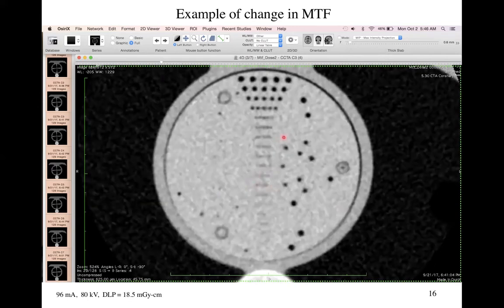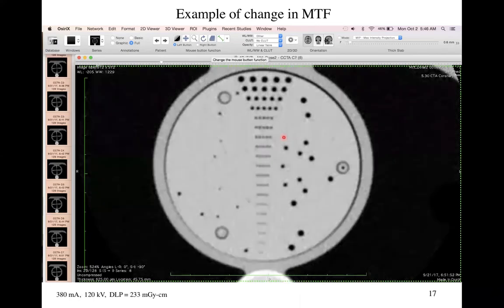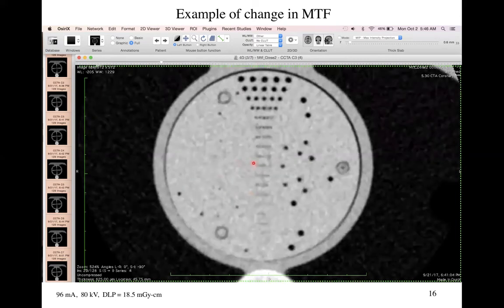If you go back and look at that, here's the noisy one, and here's the less noisy one. So essentially, what's happening is when we're trying to keep the root mean square deviation, or the amount of noise in the field of view, to a respectable value, we blur the picture.